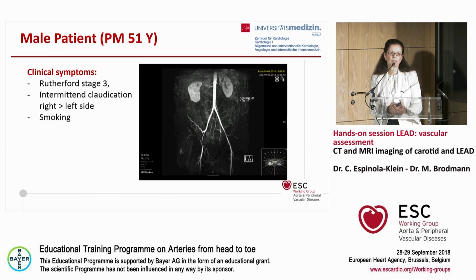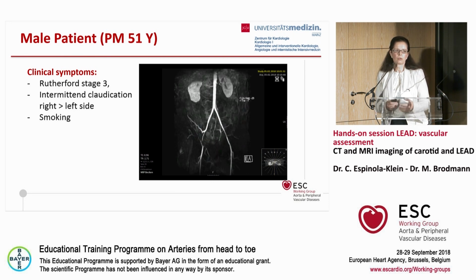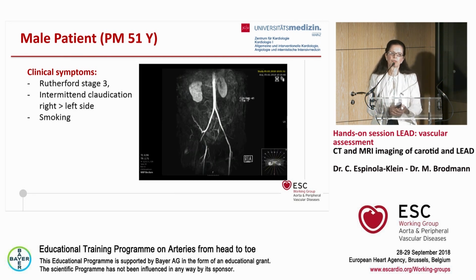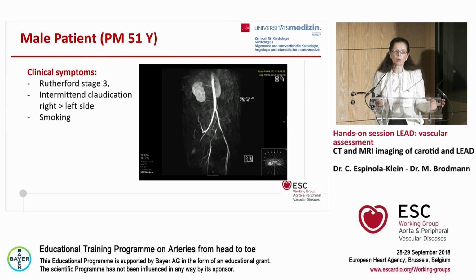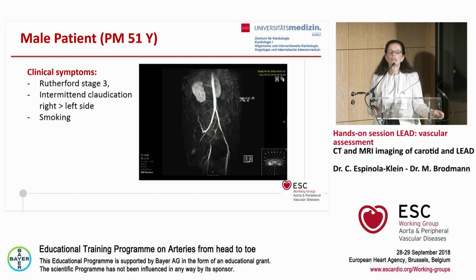He is working in transportation of things, of packages and so, and he cannot work at the moment. That's the main problem for us. But you are absolutely right. We have to check the coronary arteries in this patient because there is a high probability to have a coronary artery disease.